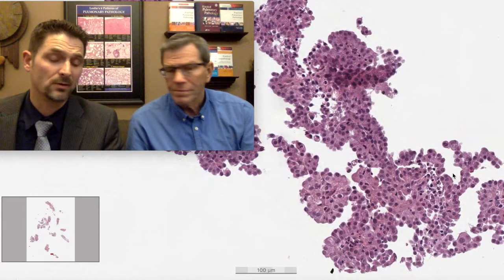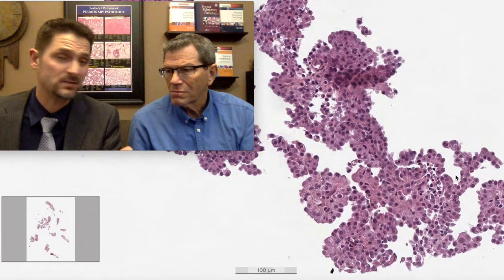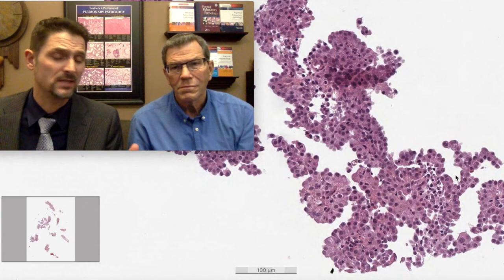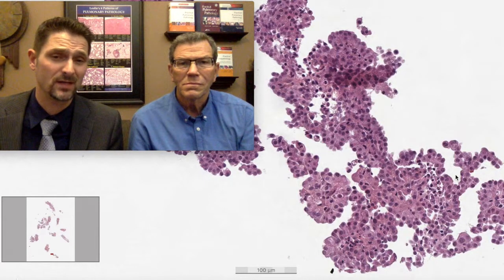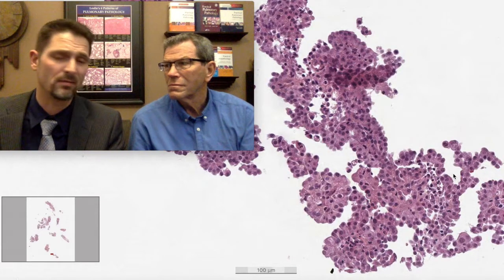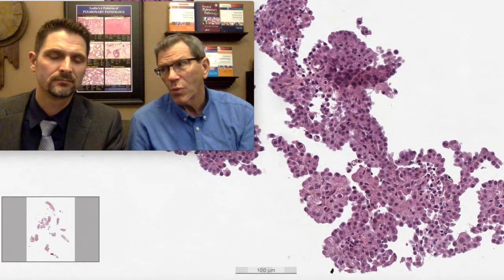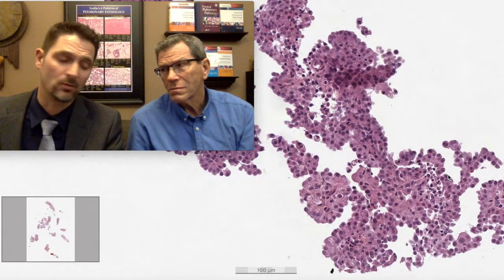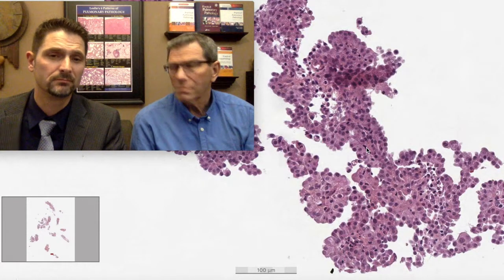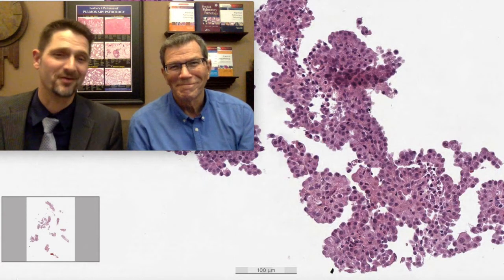The fortunate aspect here is that most cases that come in are straightforward like this. So the diagnosis of meso should be easy, and most often it is. When it's not, it's okay to take a step back and call it atypical and think about some of the other possibilities. We haven't even talked about sarcomatoid mesothelioma, but we will at some point. That's a whole other story, because that can be a challenging diagnosis. But if you're having trouble with it, send it to Max, and I'll call it atypical.